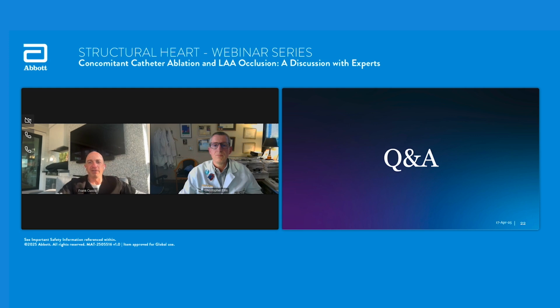On the chat screen there, for some reason, the chat screen came up at the same time. Yeah, I apologize. So Chris, your question was, what do I do if there's a DRT? Let's say you go through that first month up to 6 weeks or whatever on the anticoagulation. It's a high risk bleeder, transition to DAPT is your plan, but they show up and there's actually thrombus on the device. So they've developed thrombus despite anticoagulation in the early post-implant time window.